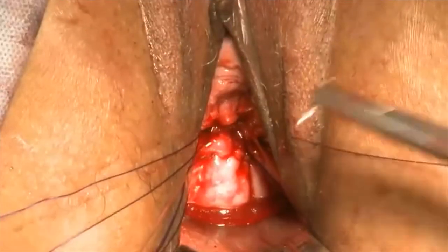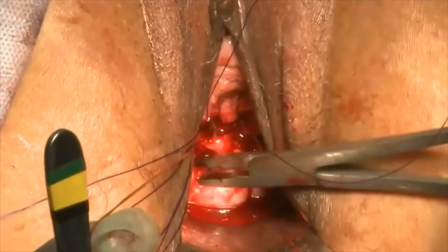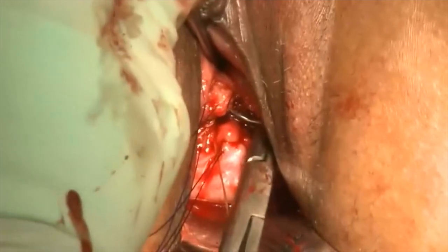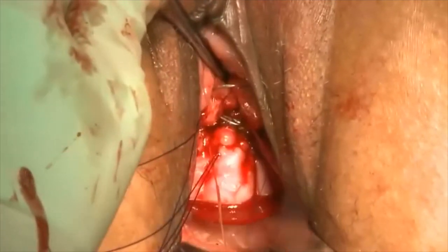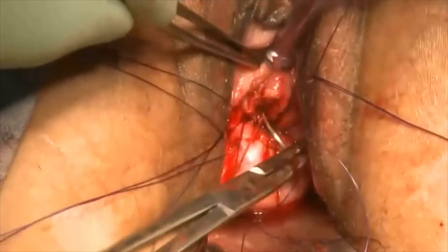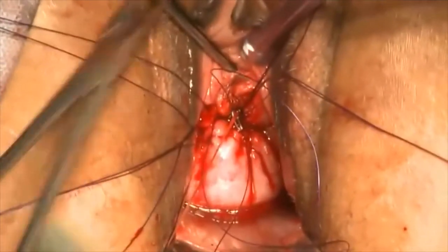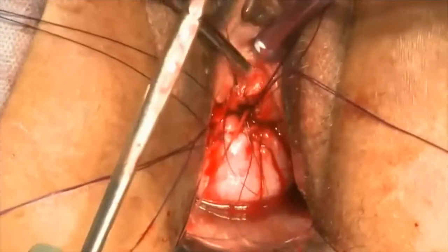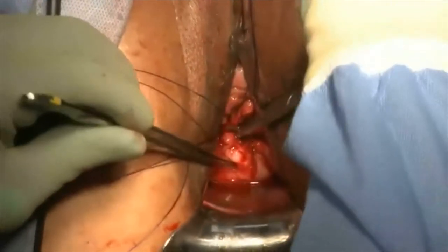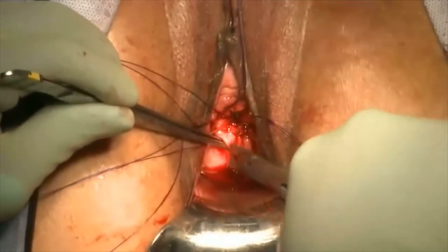I go through the full thickness of the vaginal cuff. I don't worry about the suture not being on the external cuff, because this is a PDS suture which will ultimately dissolve within three to four months. A similar process is performed on the patient's contralateral or left side, with the most distal suture going through the corner of the vagina, the next suture up going medial to the corner suture, and the most proximal or deepest suture brought through the middle of the vagina.